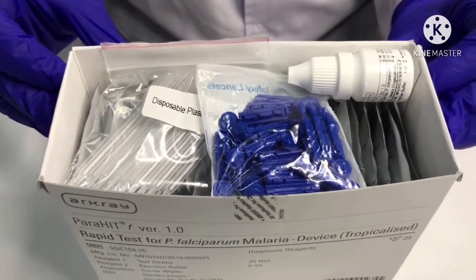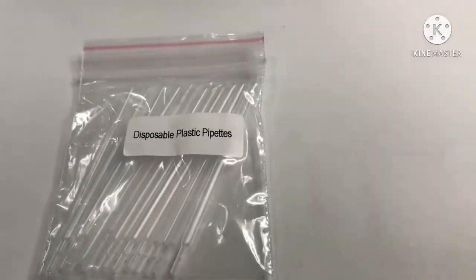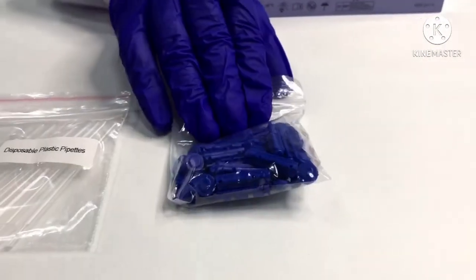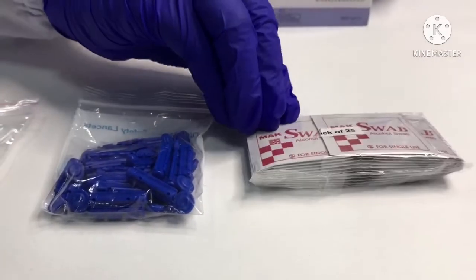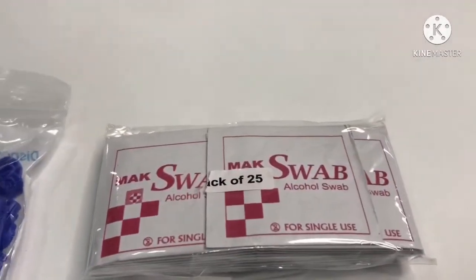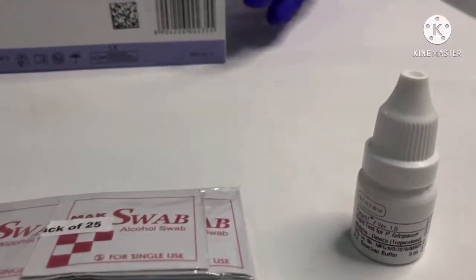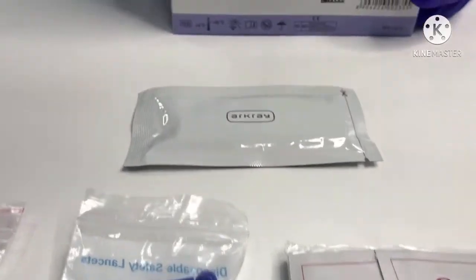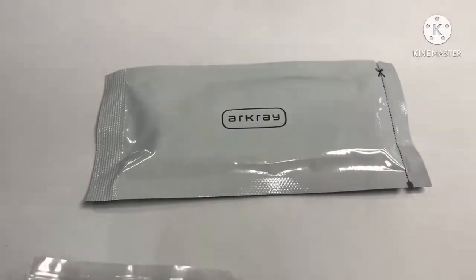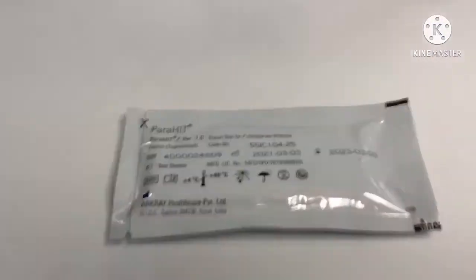Kit components are: disposable plastic pipettes, sterile lancet, sterile wipes, reaction buffer, and the Parahit F test device.